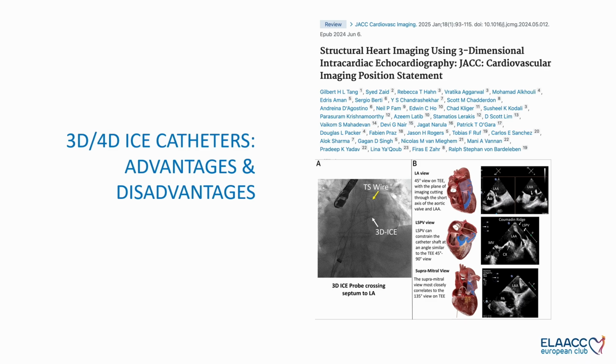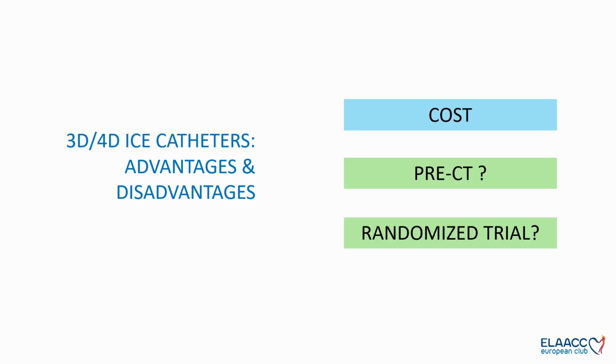a structural heart imaging position statement using 3D intracardiac echo. So I think it's the current situation that most of the centers are willing to use this, especially in the US.